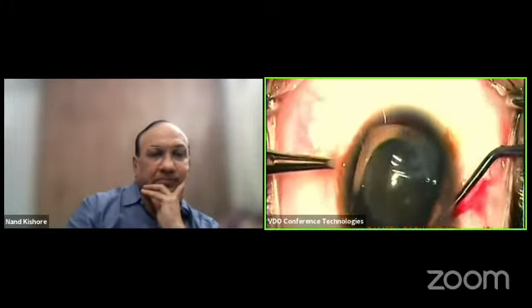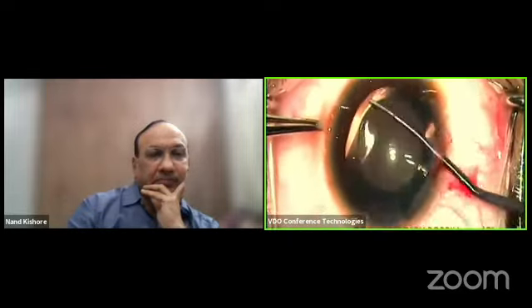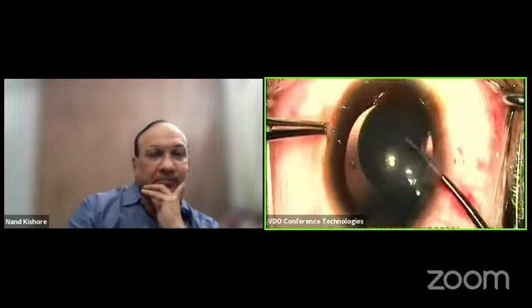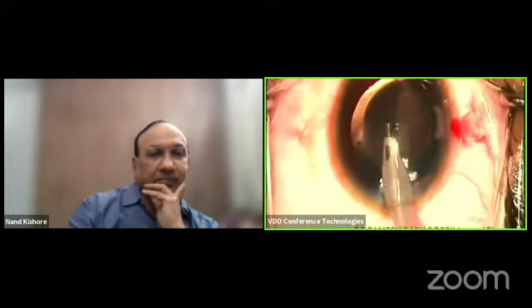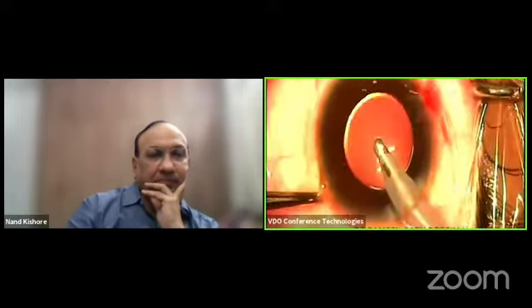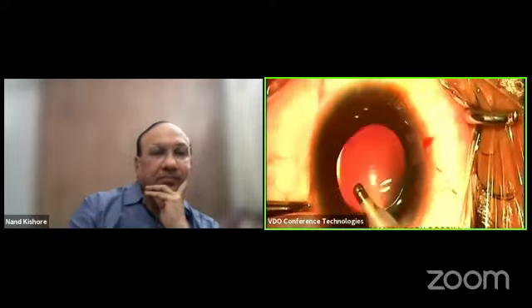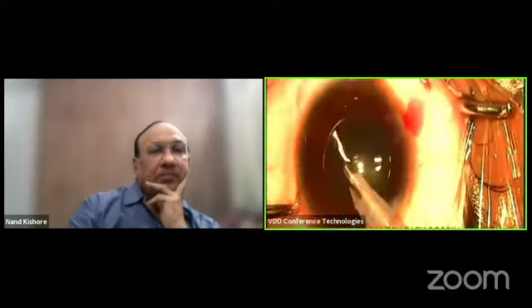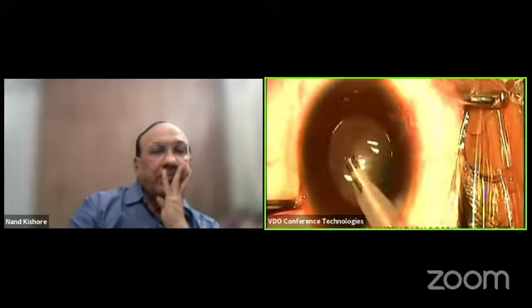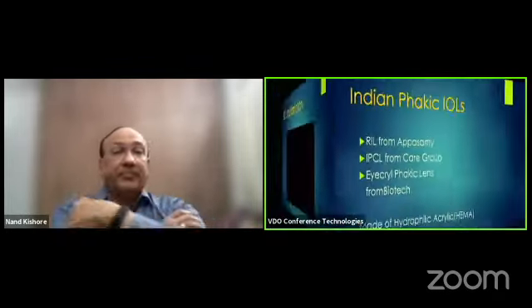We have chosen a little longer lens, so that is the reason we have tried to rotate the ICL vertically. Now the viscoelastic is being removed. A rinse through the aqua port, which is the central hole, aids in removal of the viscoelastic from behind the lens. We need to take plenty of time to wash out all the viscoelastic from the anterior chamber, so that there won't be any postoperative pressure hike. Then the wounds need to be hydrated like this.